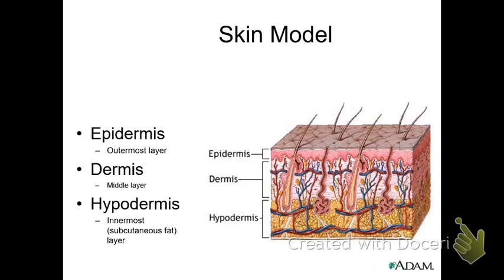The second part of this lab is to learn just the very, very basics about skin. And so you are to learn just simply the layers. Don't worry about any other details. When we get to exam 2 in class, we'll deal more completely with skin structures. But for now, I just want you to know the 3 layers of skin.